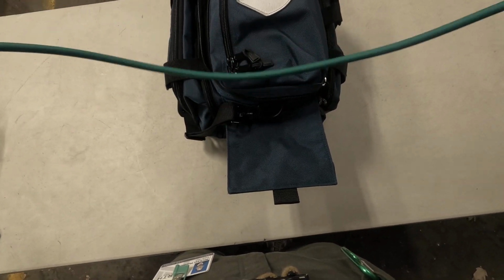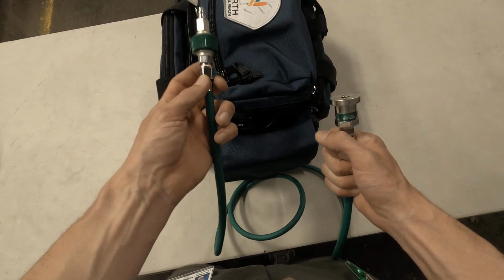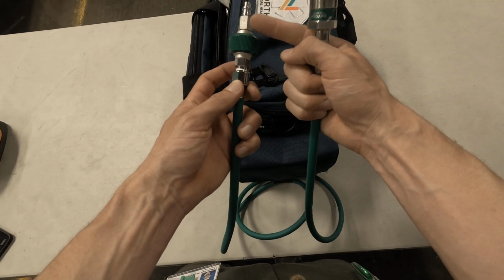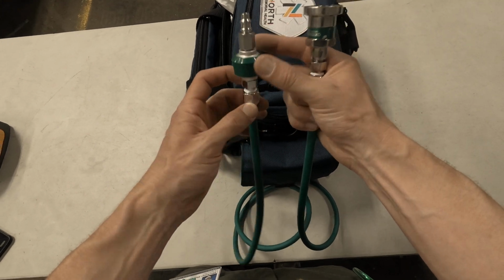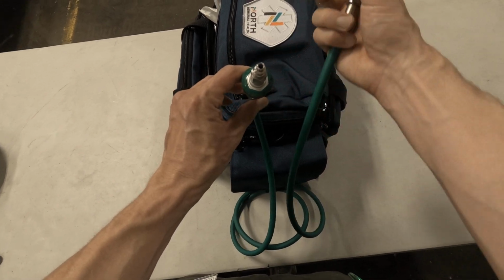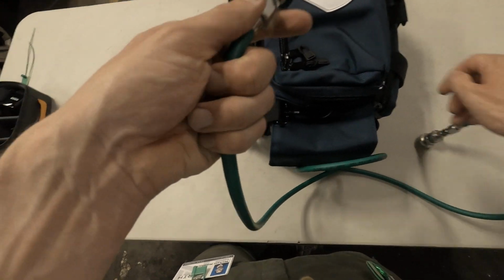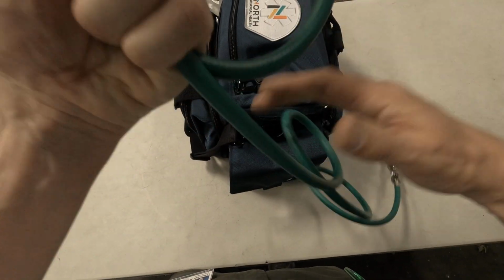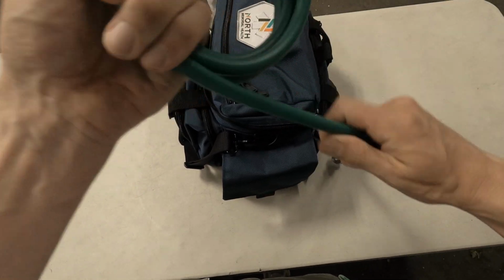But this one, you can attach your vent to this side, and then this side will go into the wall at North or Abbott. And there are a couple others that I can't remember, but if they have that hexagonal shape after you take the regulator out, this one will fit into that wall. So it's nice to have just in case your patient is on a high FiO2, or if you don't have a lot of oxygen left.